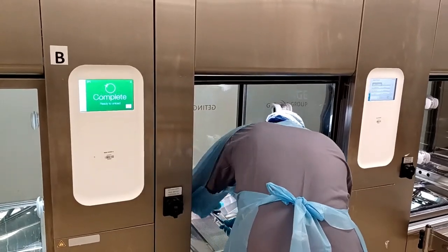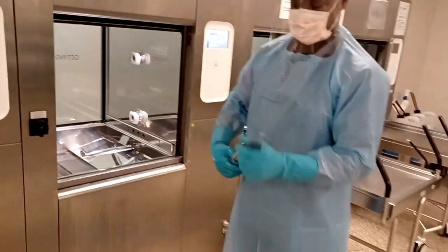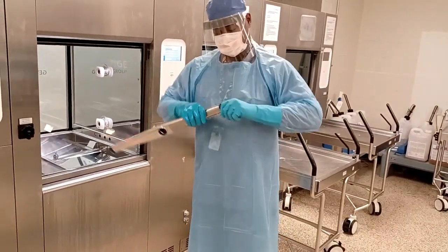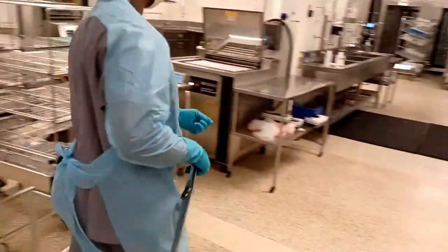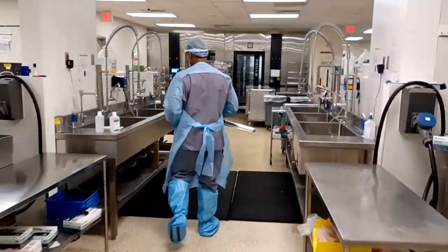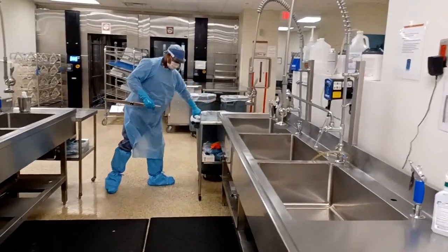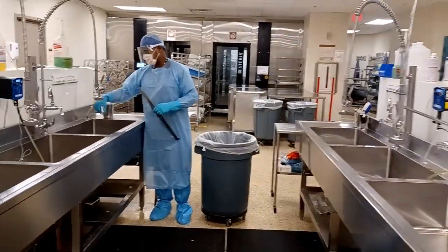Checking the spray arms inside the washer and the filters daily helps to ensure that the correct amount of enzymatic, detergent, and solution is being dispensed properly during the wash cycle. This also allows your instrumentation to be rinsed properly. You want to inspect and clean the spray arms inside the washer and all the washer racks, and check the filter in the bottom of the washer daily.